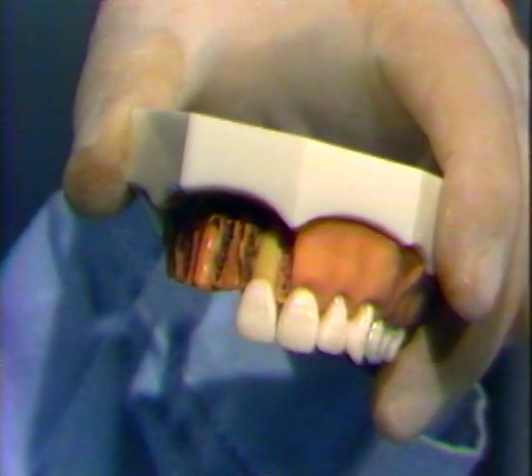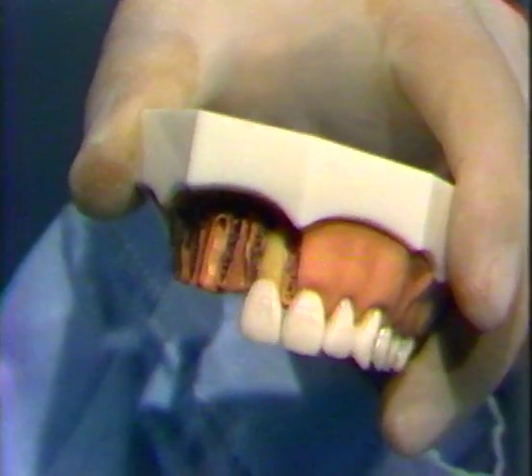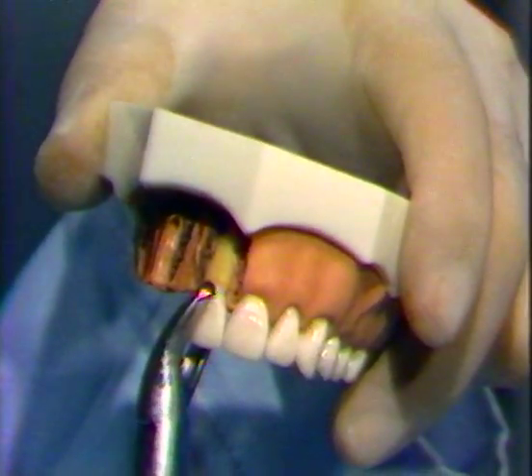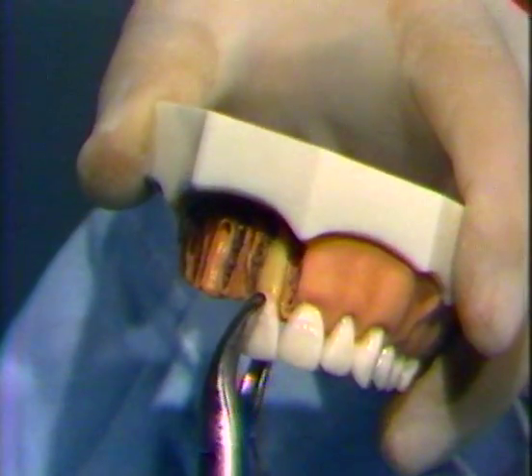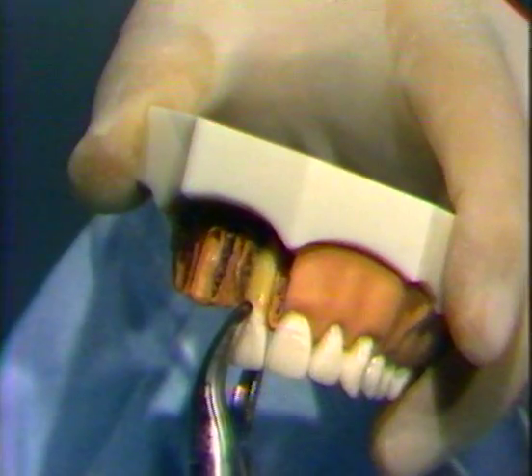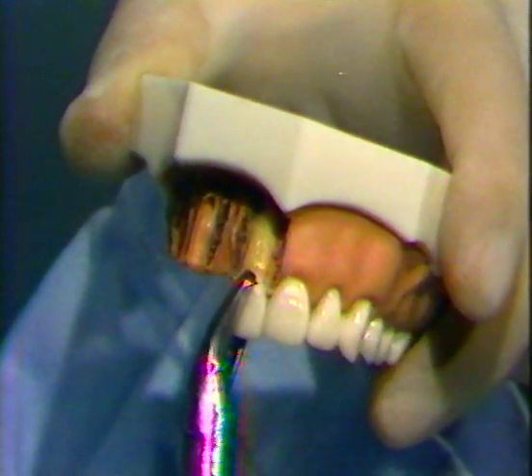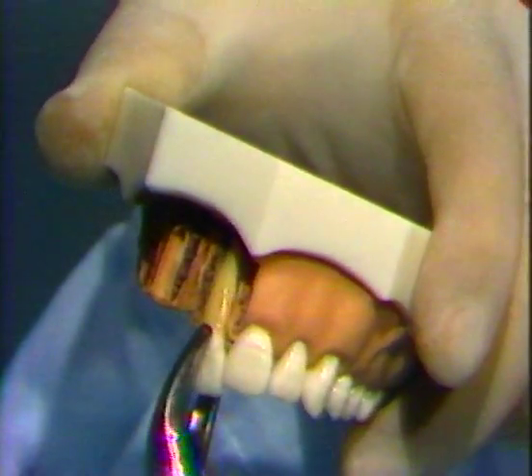For the central incisors, the procedure is much the same as with the laterals. First, movement to the labial side, then to the palatal side, followed by a rotary movement from labial to distal, and then rotary movement labial to mesial. The final movement is downward, while gently luxating in line with the long axis of the tooth.